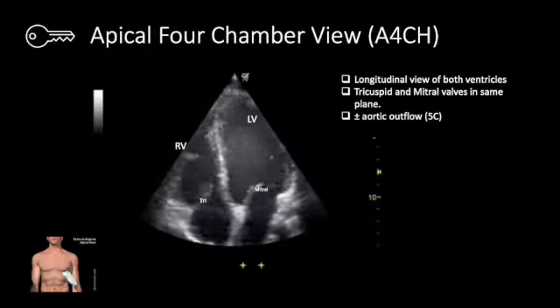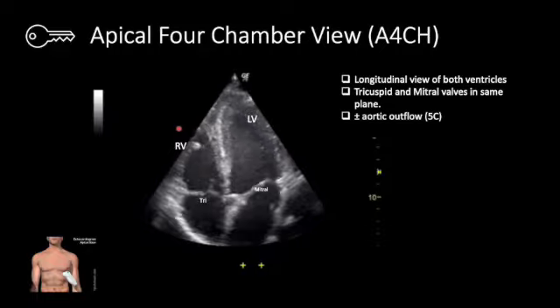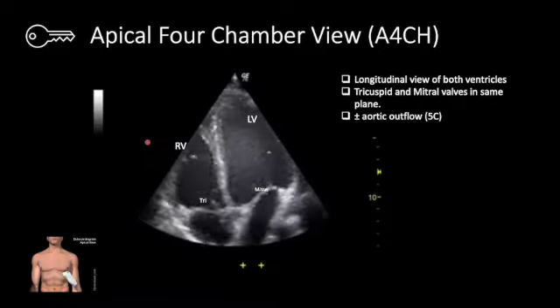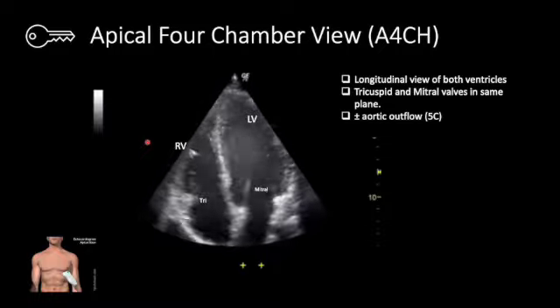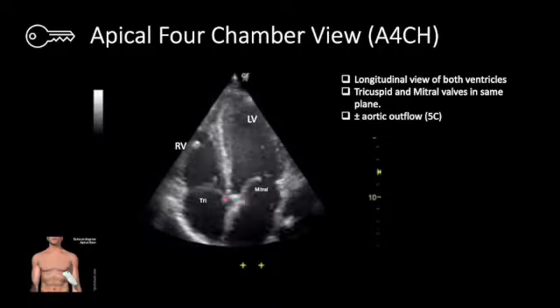A couple other unique anatomical findings present in this view include an echogenic band, which I'll kind of circle here, that's present only in the right ventricle, in the apical end, which represents something called the moderator band. This can help differentiate right versus left if you ever get turned around or if you're ever doing a fetal echo for some reason. We can also see the trifold appearance of the aortic valve popping in and out of view right down here.